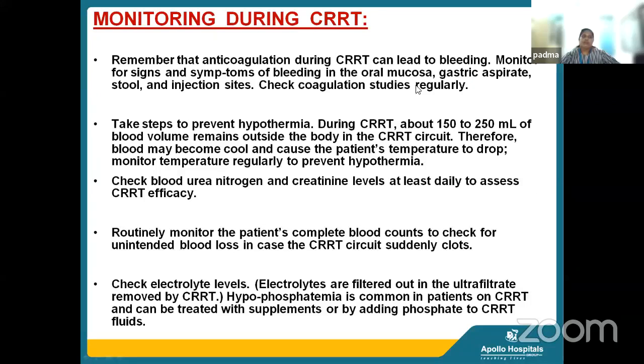So for monitoring during dialysis, we always remember that anticoagulation during CRRT can lead to bleeding, so monitor for signs and symptoms of bleeding in the oral mucosa, gastric aspirate, stool and injection sites. Check coagulation studies regularly based on the doctor's order.